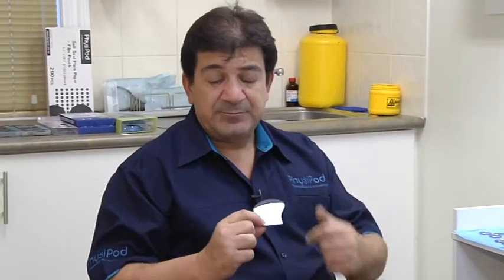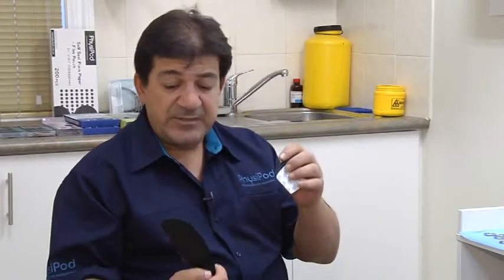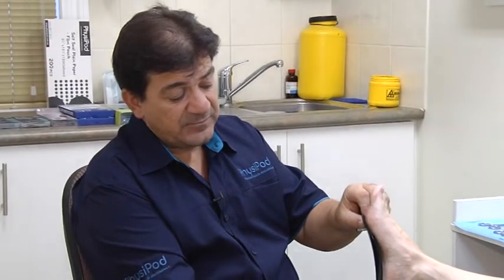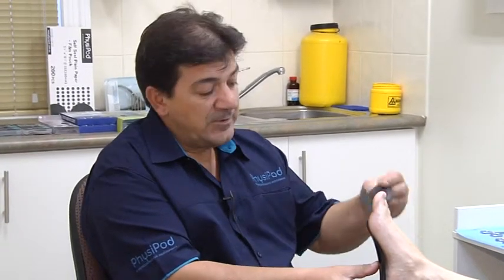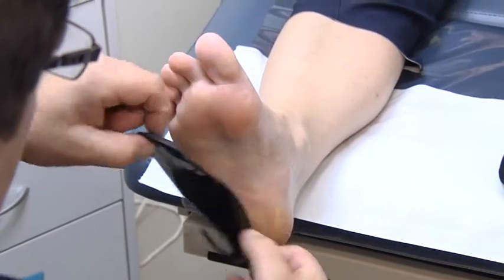On the backing of the insert we've got a self-adhesive backing. You simply pull it off, choose the designated sizing of the orthotic, and place it up against the foot in the position it would be in the shoe, then slide it down into the position where you want to offload.